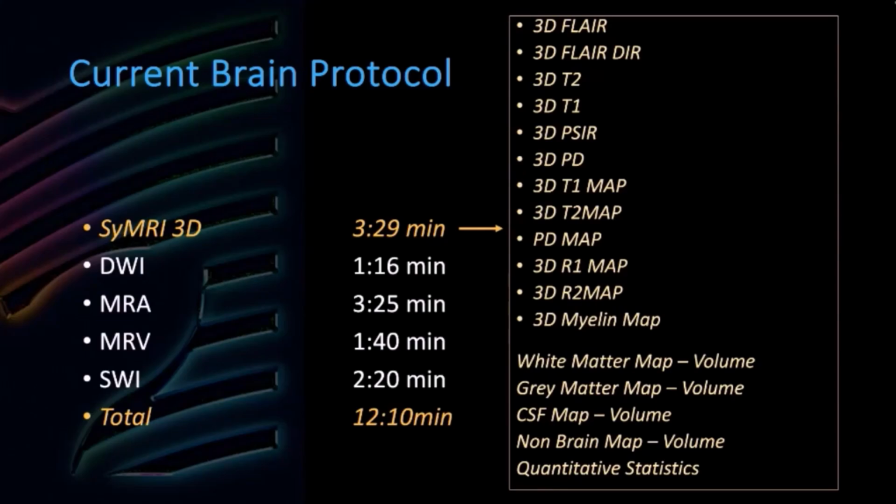One of the things to be careful of here is the amount of data coming out will really fill up your PACS. So really tailoring what you want to put out of this is something that's totally up to you, but you always have the choice to go back and manually interrogate anything after the fact and customize what you want. But it's an amazing amount of data that's coming out of these, so it's quite an exciting time of scan time for the amount of data that's coming out.